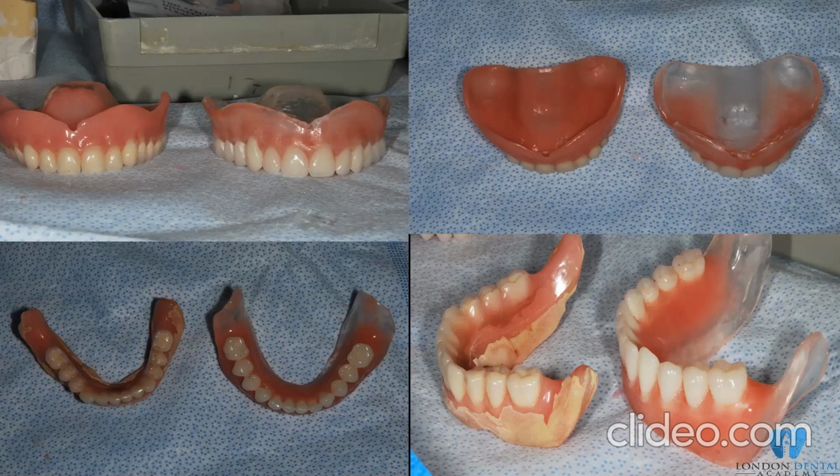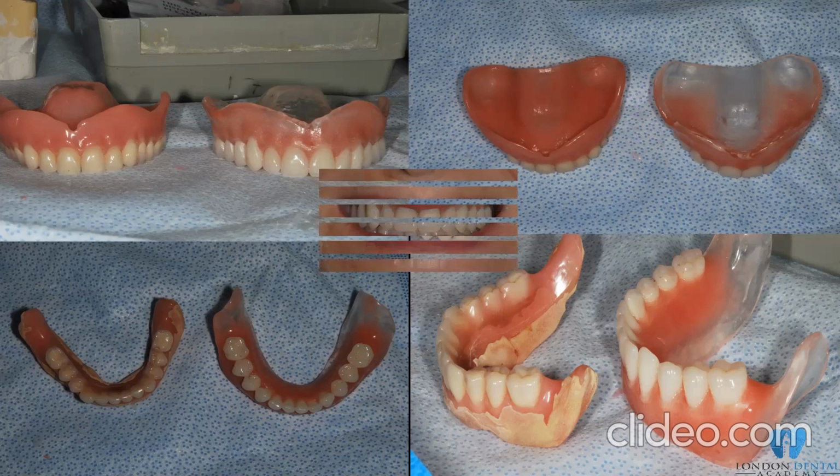But if you get 80, 90%, even 60% right within these conventional mechanisms, techniques and tools, then the implants will enhance your success rate and make a difference to the patient's life, and justify the cost which you will ask the patients at the end of the treatment.